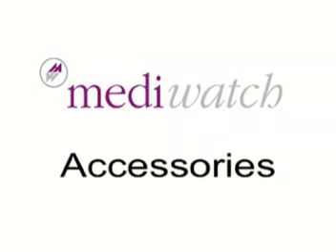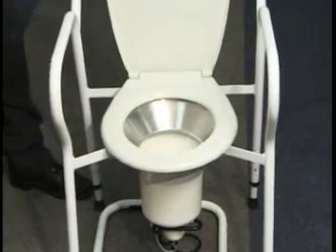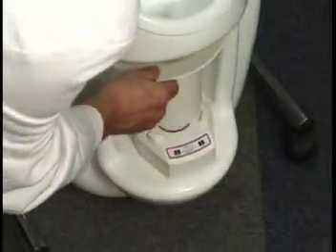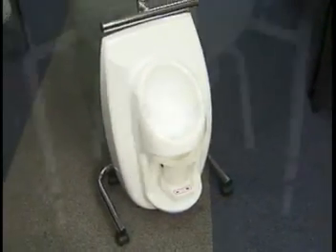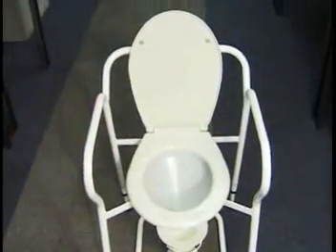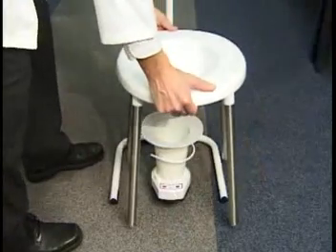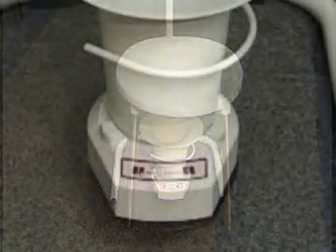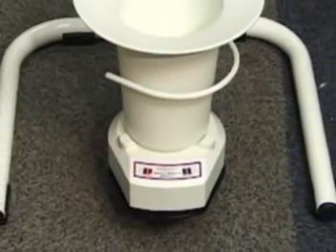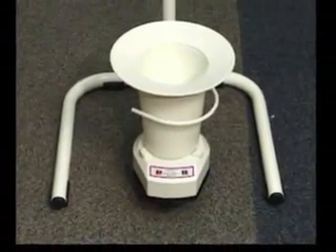MediWatch offers a number of optional accessories designed for different clinical demands. For the wireless spinning disc flow meter, a commode is available. For the wireless weight cell flow meter, the following options are available: a urinal option for male patients, a commode option for all patients, and a mobile stool for outreach. The weight cell flow meter is supplied with a frame designed to prevent the pot from being knocked over and to protect the weight cell from bumps and knocks while recording. It can be used with the commode for male or female use, or on its own for male-only use.